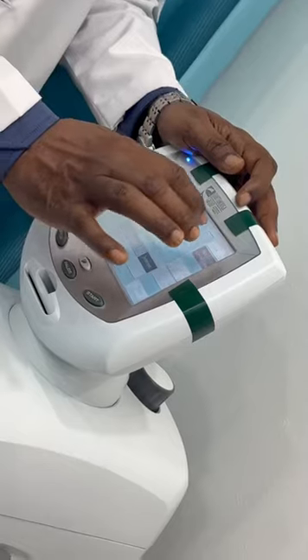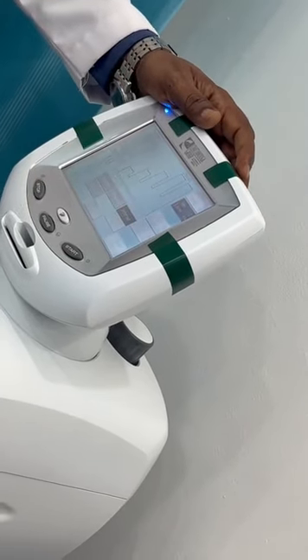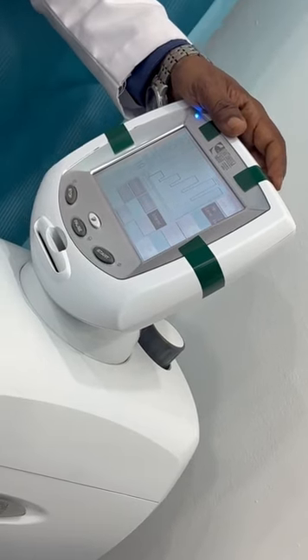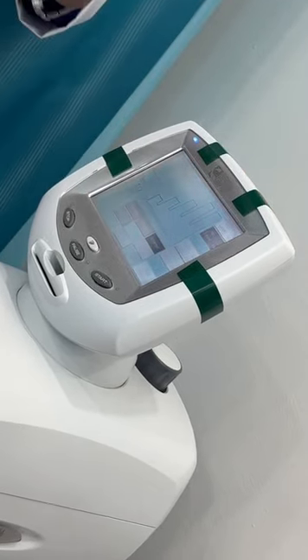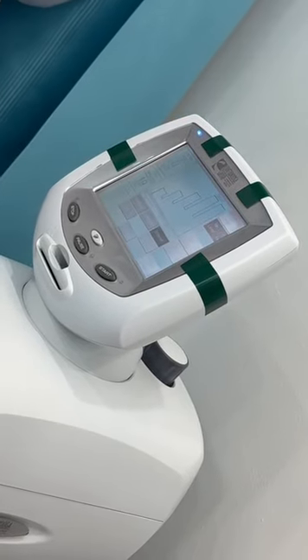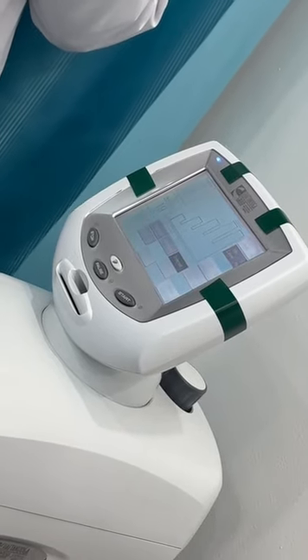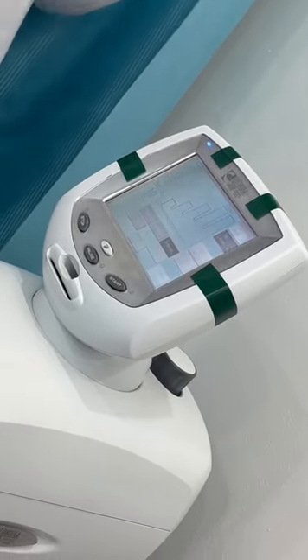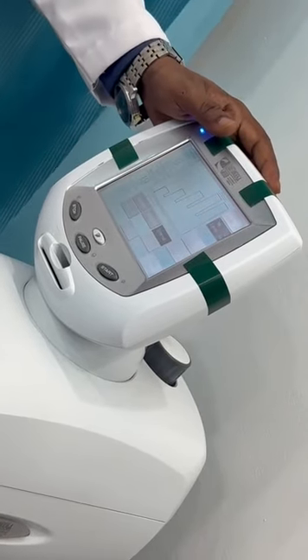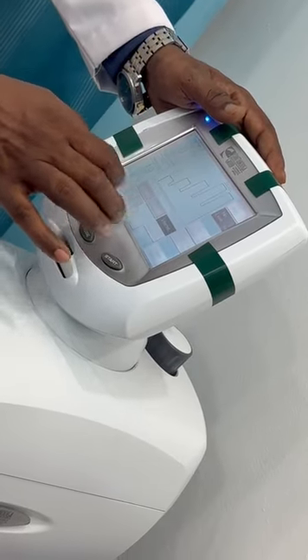Okay, only very little time for the down. Okay, done. Better to keep it equal so that it keeps pulling and maintaining, so that there will not be any sudden change, otherwise the soft tissues are stretched and pulled. Slowly you can release, slowly. If you release suddenly, sometimes there is a possibility that the tissues will not come back to the original mechanical state. Like that you can set it, usually keep it intermittent.